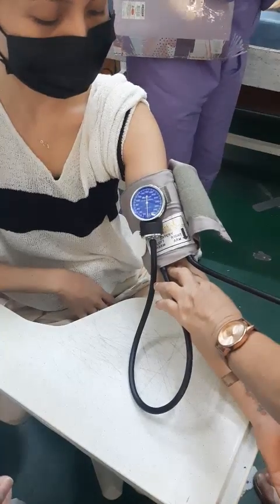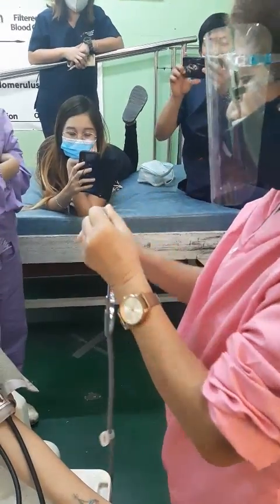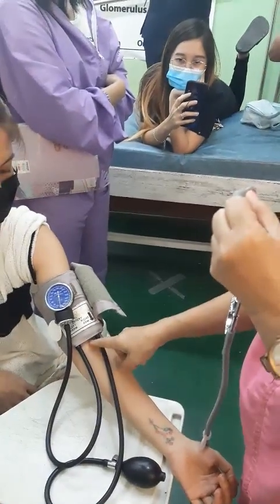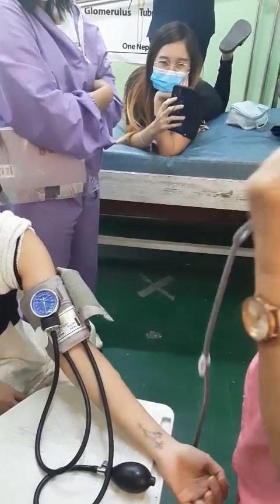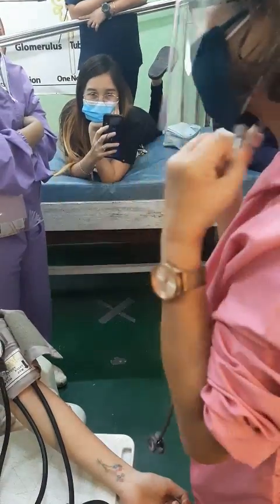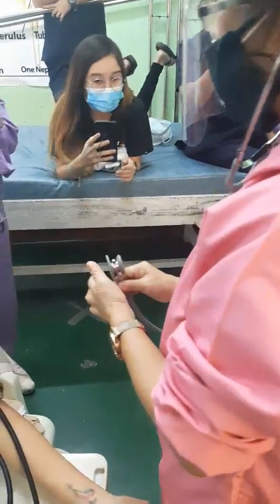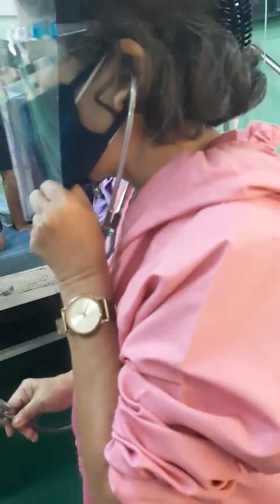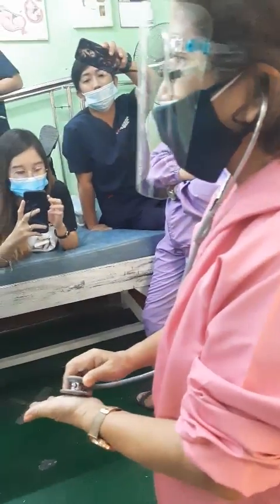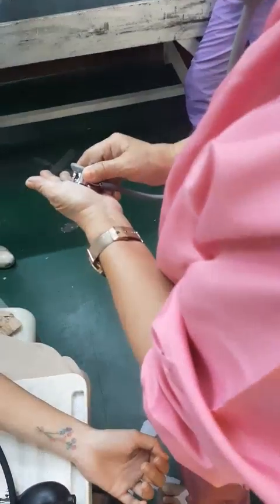The two markers on the cuff should be aligned over your brachial pulse. Which pulse? Brachial. You palpate the brachial pulse in the antecubital area. I must see to it that the earpiece is in the anatomical position. I will check which side is sensitive — the diaphragm is sensitive. I have to warm it first so the patient will not feel cold on the skin.